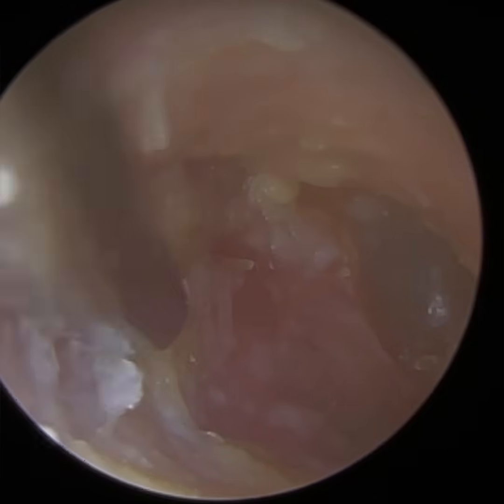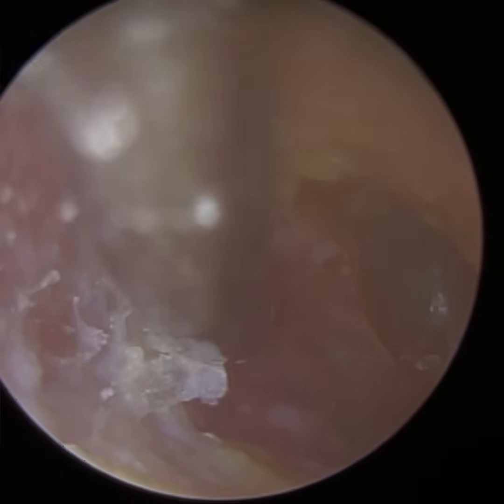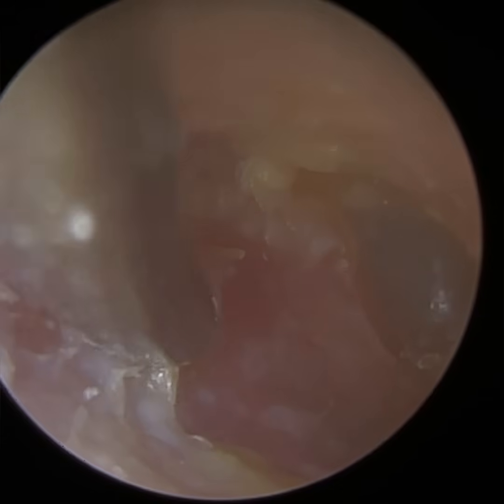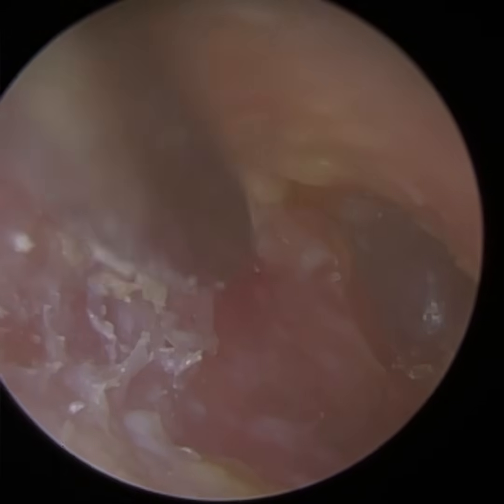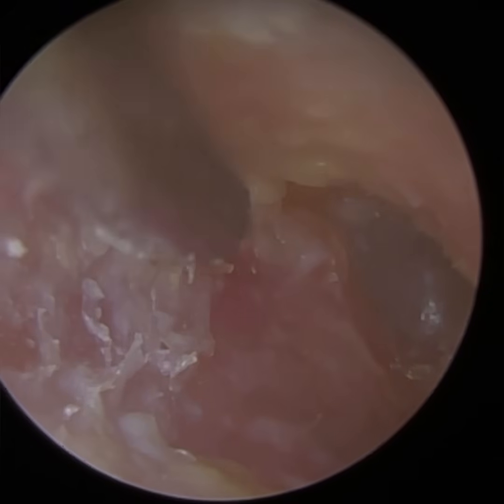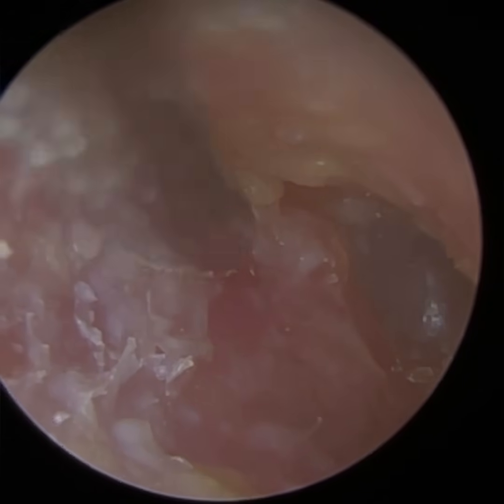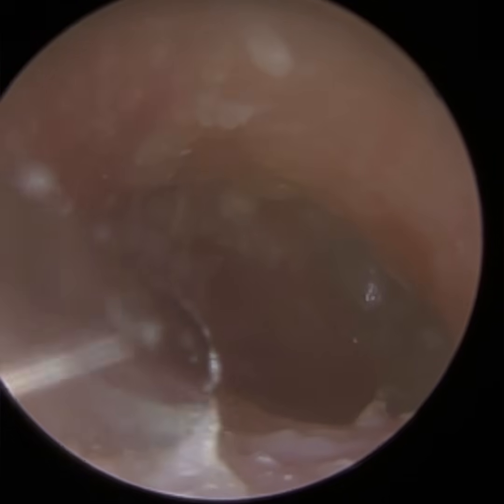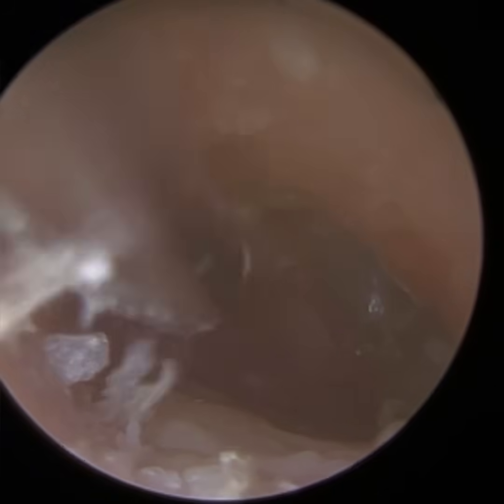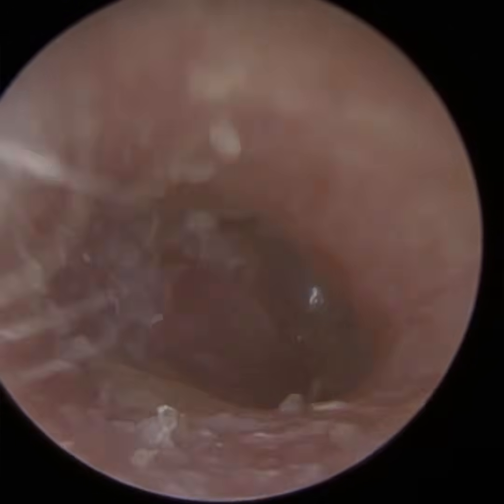So what we're trying to do here is just peel away as much of this debris. The skin's very macerated, as you can see, it's broken, this epidermis layer. Whenever the skin is inflamed, it's more tender, so we're more likely to cause trauma. So that skin is more delicate, and the last thing we want to do is cut the skin and cause more trauma, which can then, of course, exacerbate their infections. We're very, very gentle. I just want to get this macerated, soft, dead layer of skin away. I'm just gliding across the surface.